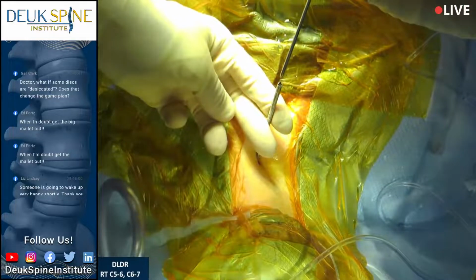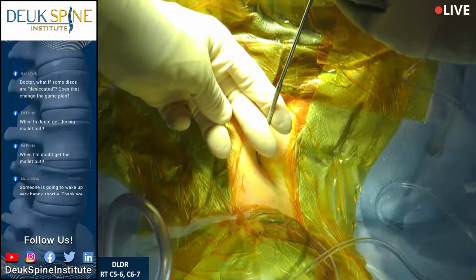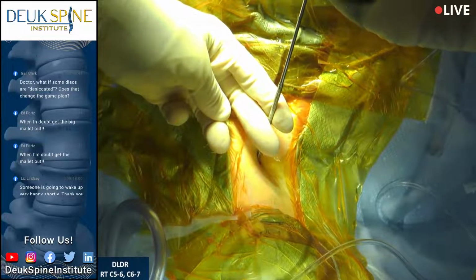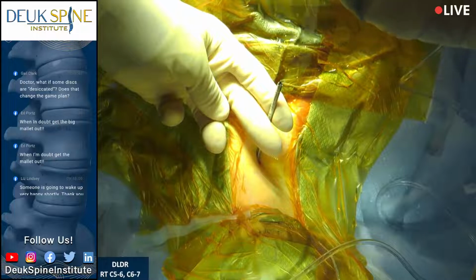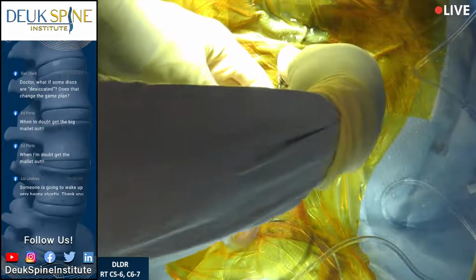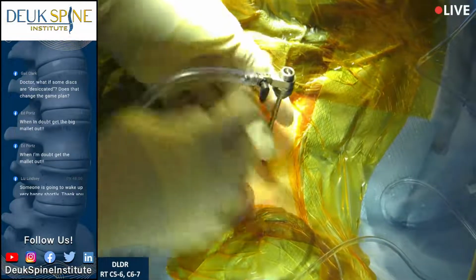So right now the mouth of this is bent a little bit, and we're trying to repair it on the fly. Let's see what we can do there. All right.